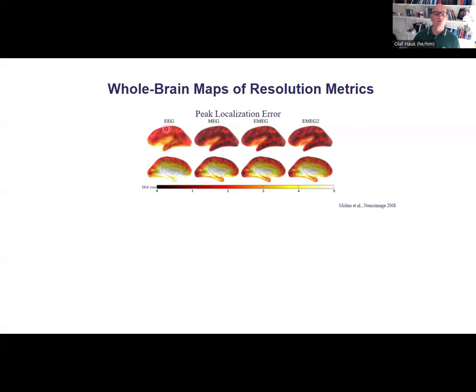So you do that for every source, and you can plot the distribution for EEG alone. Trying to remember how many electrodes they had, I think about 70. Might not be exactly true. Then for MEG, there will be 306 sensors, and then for the combination of EEG and MEG. And they also had a condition where they matched the number of MEG and EEG sensors to have a fair comparison that doesn't depend on the number of sensors, which is usually different between EEG and MEG.